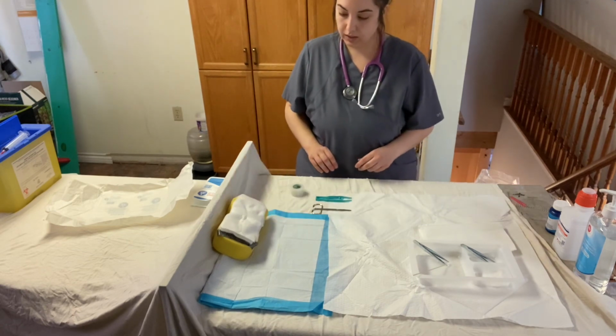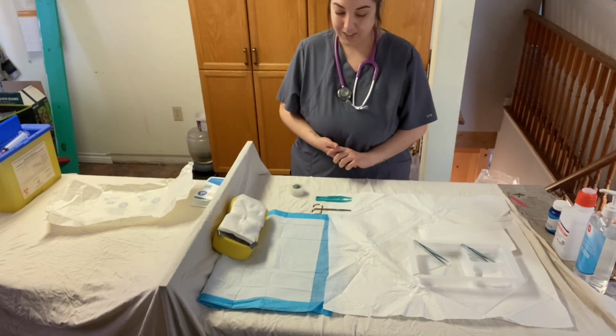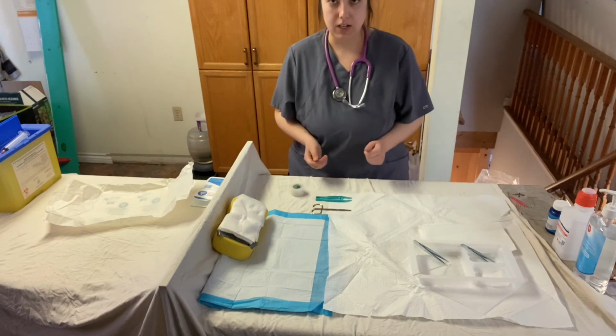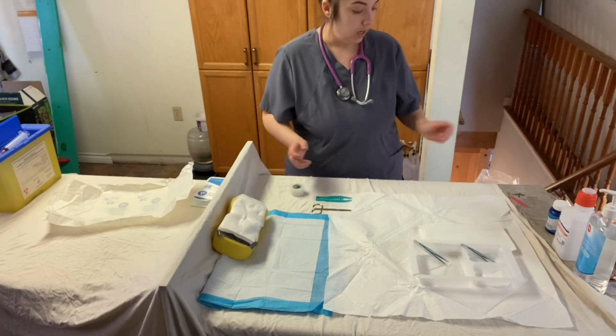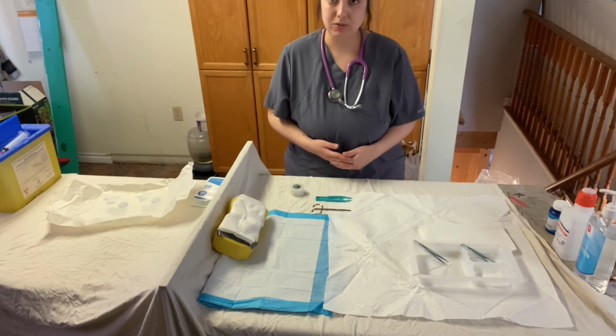What we would do next is, are you doing okay, Robert? Do you feel any pain? Perfect. Okay, then we're good to go. So what we would do next is we would clean up our sterile field. We would make sure the bed is at the correct safe height for the patient, and we would leave.